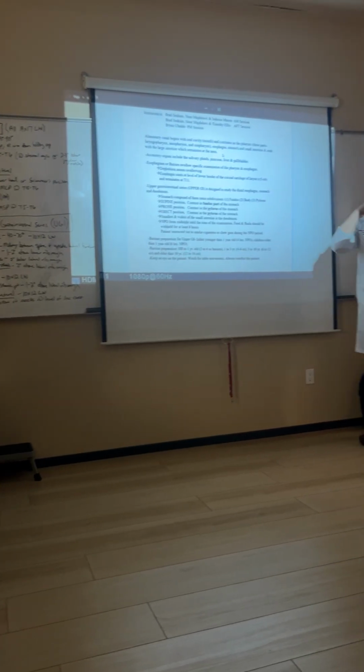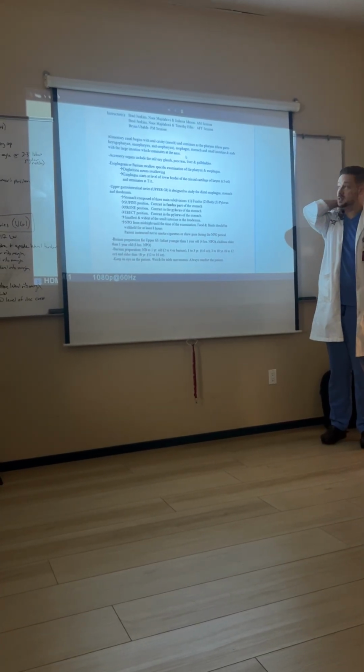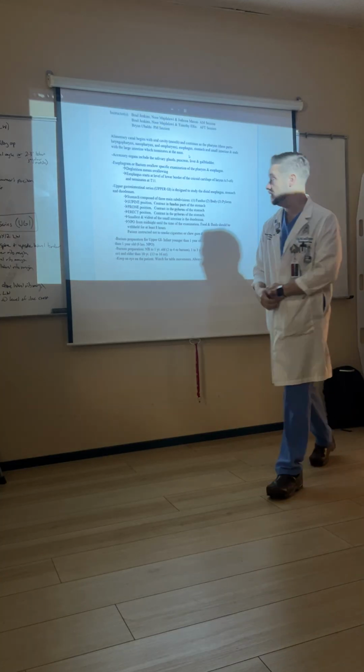Starting, again, as I said a little while ago, we're going to be starting with our fluoroscopy discussions this week, starting with the esophagram and the upper GI.